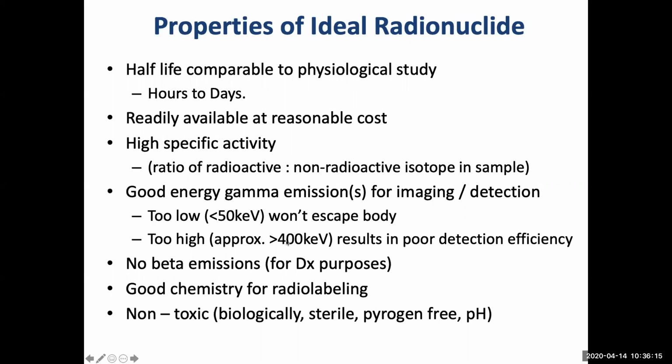While if the photon emitted by the radionuclide injected into the patient is above 400 keV, the same thing: the photon will escape from the body and also escape from the detector. It will not be stopped and detected by the detector. Most of the photons will escape from the detector without any recording. So we just expose the patient to high-energy photons without any benefit to the imaging. So we need reasonable energy.